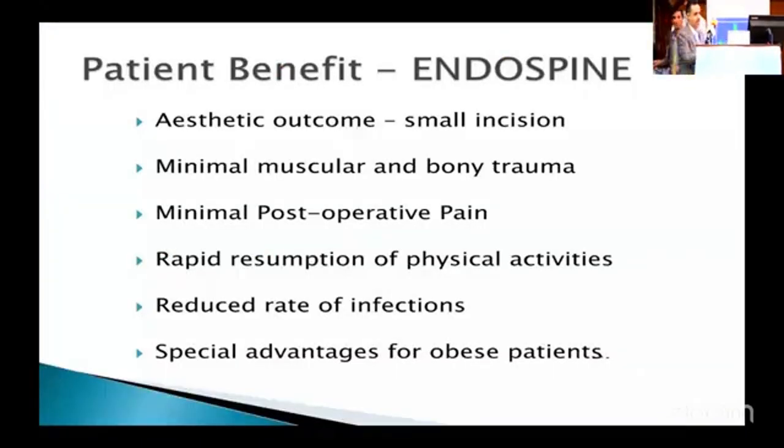The patient benefit is that most of our patients are done under local anesthesia, with a small incision, less muscle and bone trauma, less post-operative pain, and fast resumption of life and physical activities. Also, the rate of infection is reduced, especially here in our hospitals in Yemen. And the most advantage is for obese or fat patients.